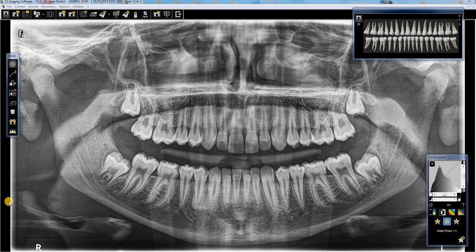Hey guys, this is Dan from CareStream. Real quick, I'm going to show you how to use the CS ADAPT filters for the panoramic images taken with the CS9300, CS8100, and CS8100 3D, and the CS9000 and CS9000 3D.